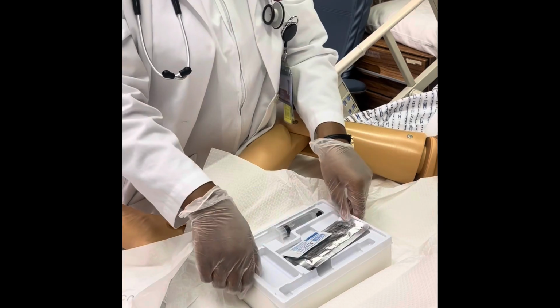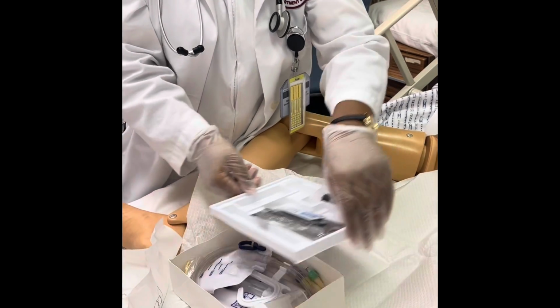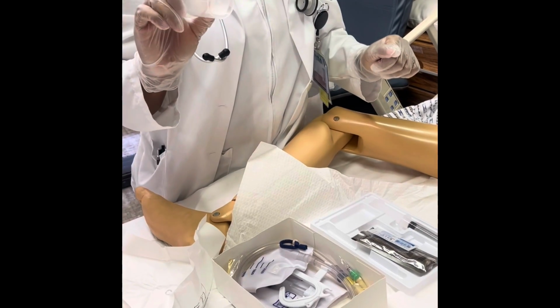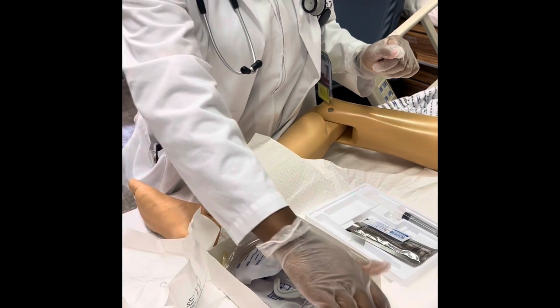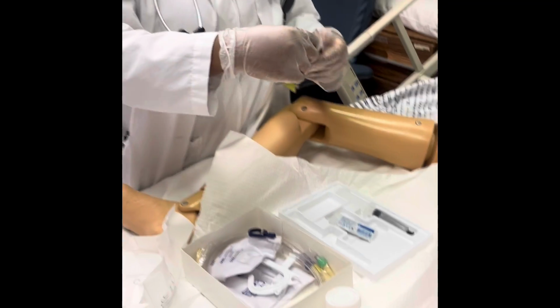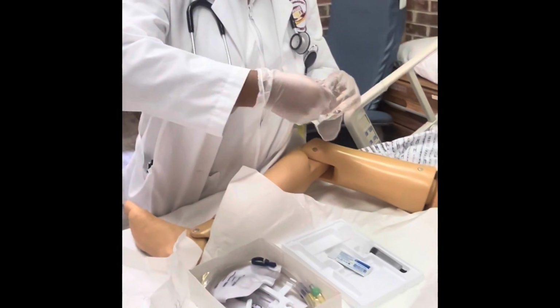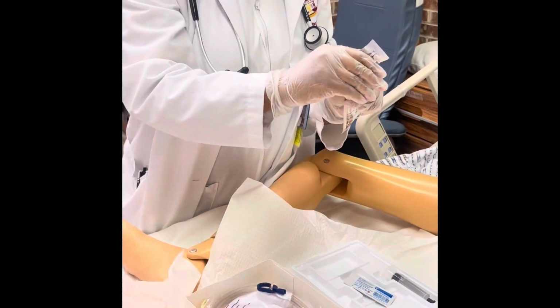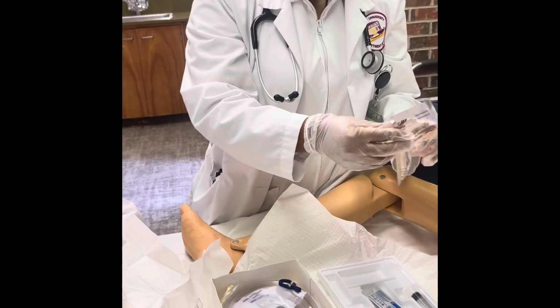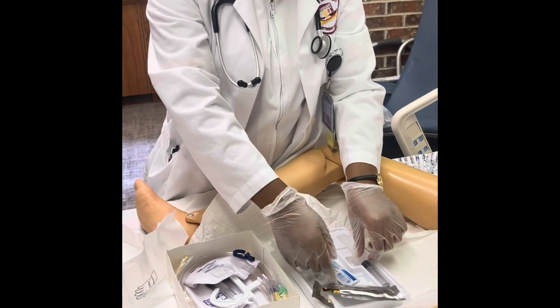But next, I'm going to set up everything. This is my urine collection cup, which I am going to be using later because I'm going to get some urine from him. I could first start by opening my iodine swabs. Send them to the side for now.